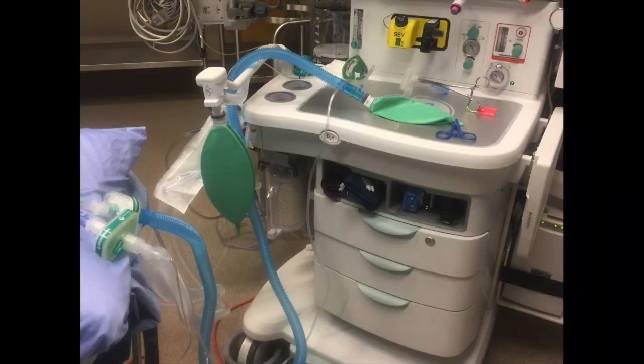This is the circuit shown in its entirety. The manual ventilation bag is sitting on the table where we can most easily visualize it throughout the case.